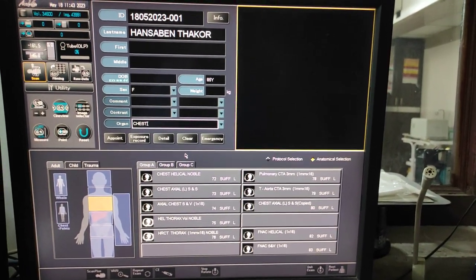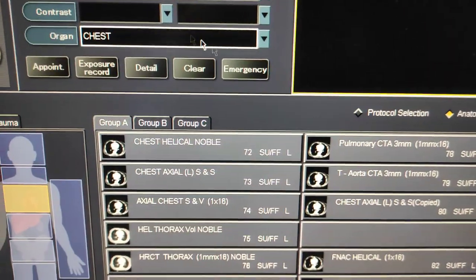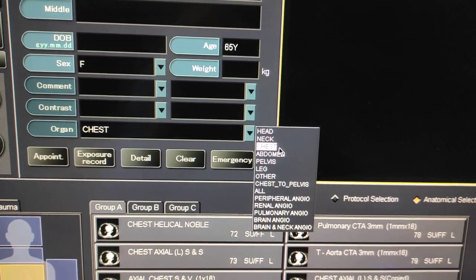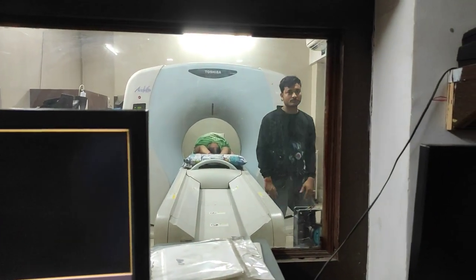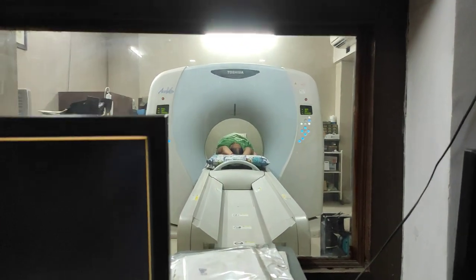First of all, you have to fill the patient data: ID, patient name, age. Then you have to select the organ. HRCT will be covering the chest, so select chest. The position of the patient is feet first — you can take head first as per your preference, but here I am taking feet first.